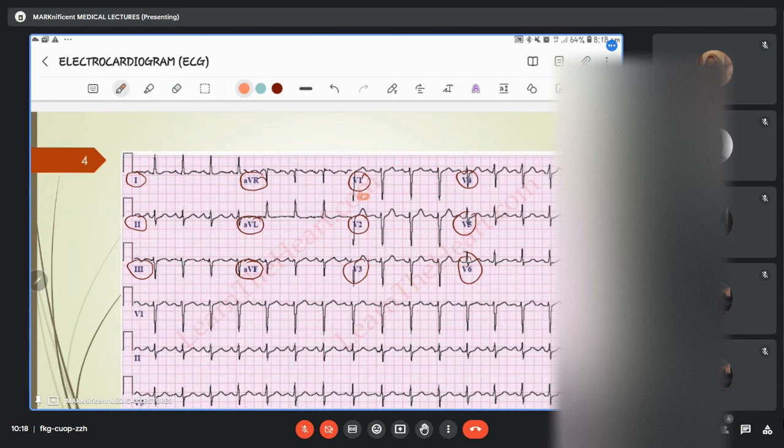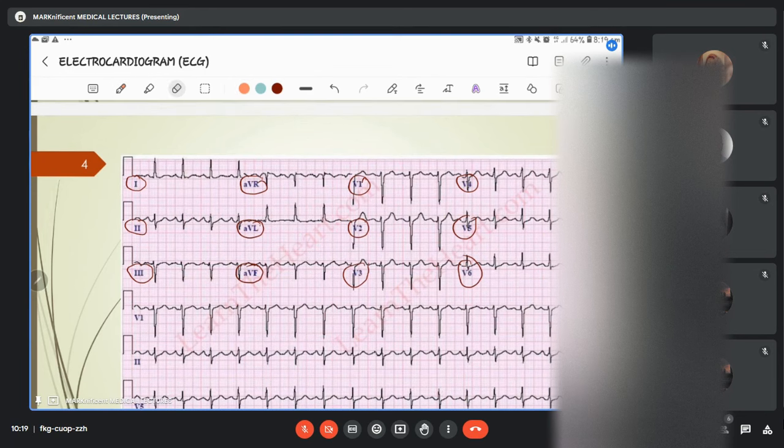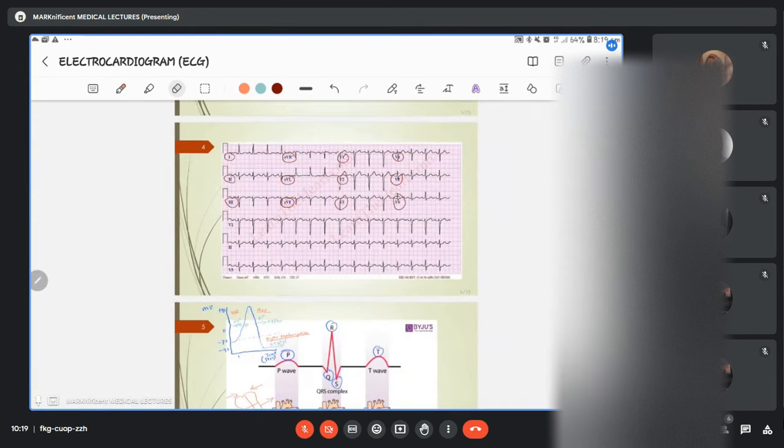This is the V1 here. So by the time you have all those abnormalities relating to the V1, then you will make your inference that, okay, this is left atrial hypertrophy, this is right atrial hypertrophy, and all of that. So that's why we are making reference to the V1. How important is it? Well, I think V1 actually gives the most activity.